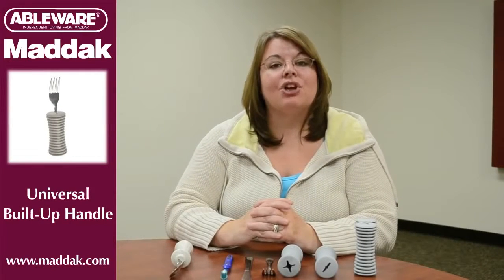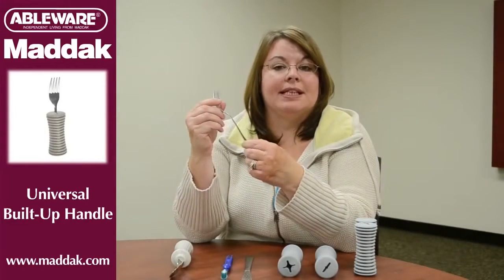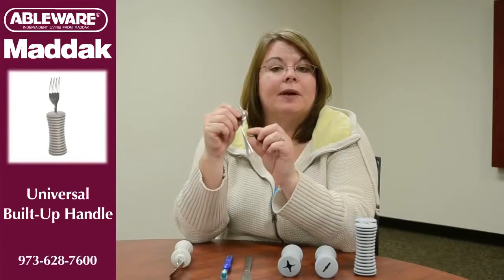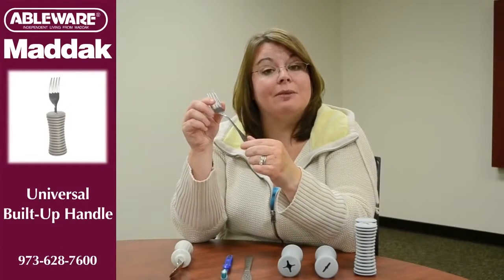Arthritis and other hand limitations often make some tasks difficult. This is especially true when it comes to eating. Most typical utensils have a really narrow handle, and this can make them difficult, painful, and sometimes even impossible to hold.